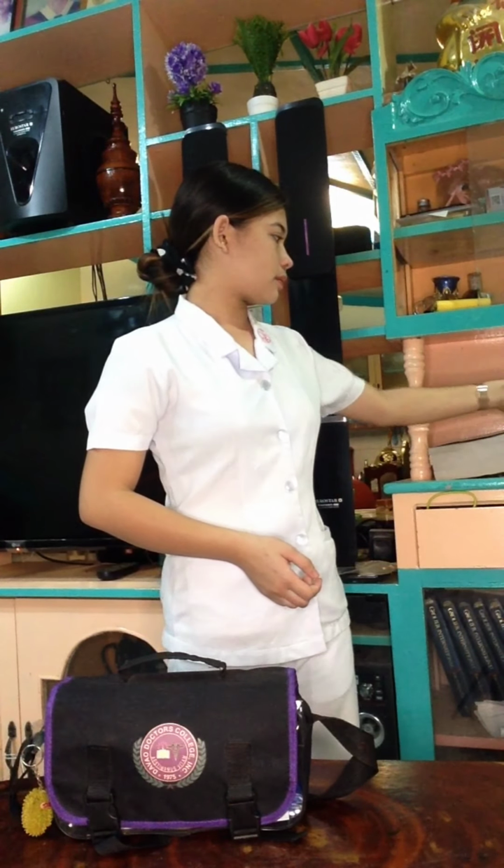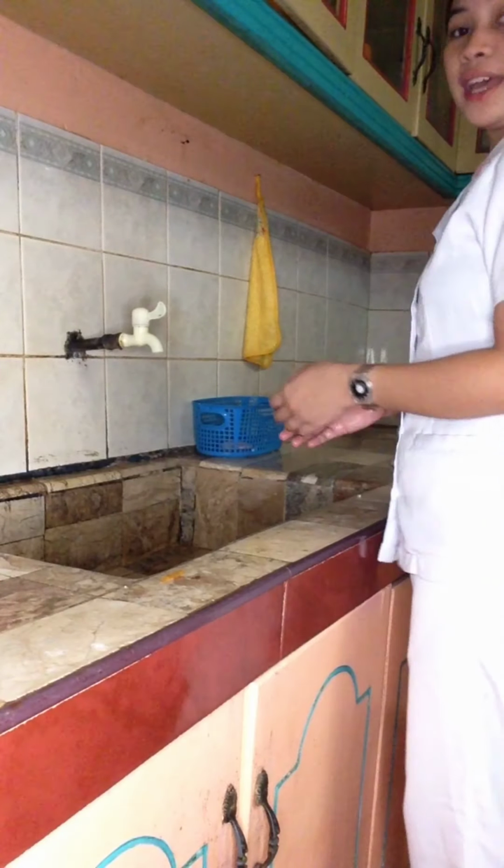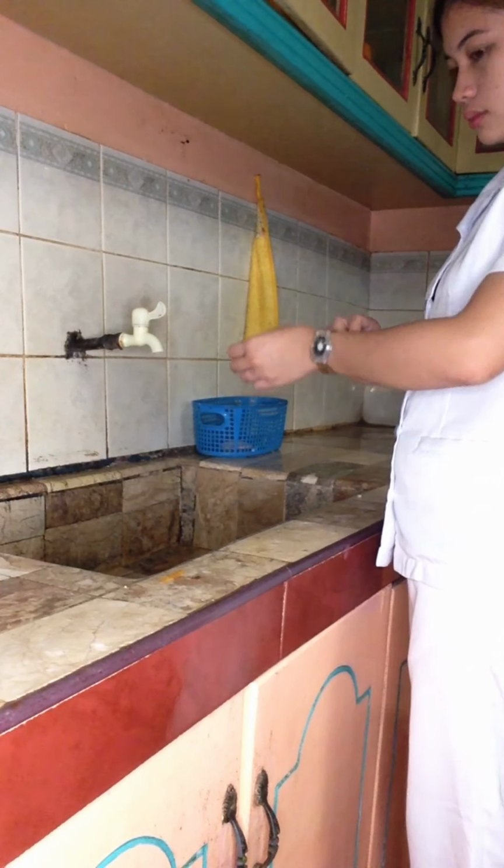So first and foremost, you need to check the doctor's order because the procedure to be performed is invasive. Next is wash your hands. This is to deter the spread of microorganisms. Then you need to remove your jewelry.